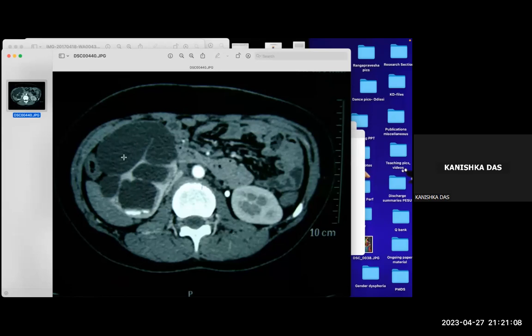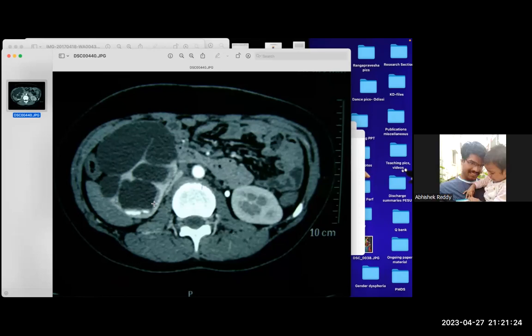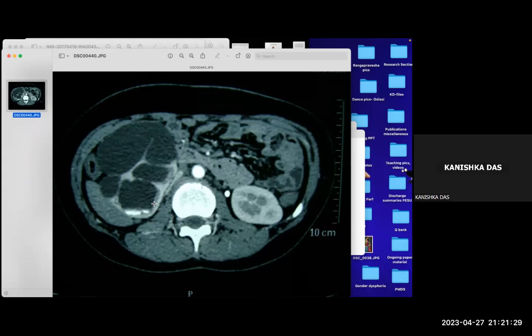So what else would it be? Inside the kidney, displacing the kidney. Suppose I tell you these are calcifications, this and this. So cystic nephroma. Yeah, the cystic nephroma is one thing. What else? Ossifying renal tumor of infancy. Okay, renal teratomas, they're uncommon, but renal teratomas also can be there. Renal teratomas, intrarenal neuroblastoma, those are all very uncommon.